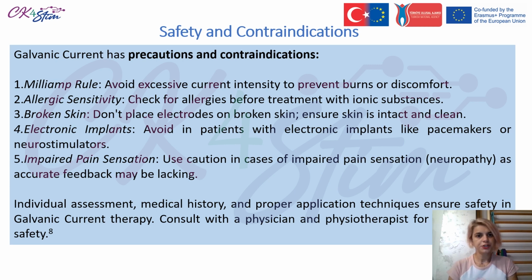We have now reached the safety measures, precautions and contraindications part of the galvanic current treatment. The milliamp rule refers to avoiding excessive current intensity to prevent burns and discomfort on the skin of the patient.